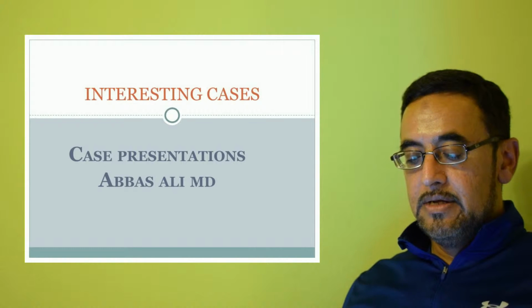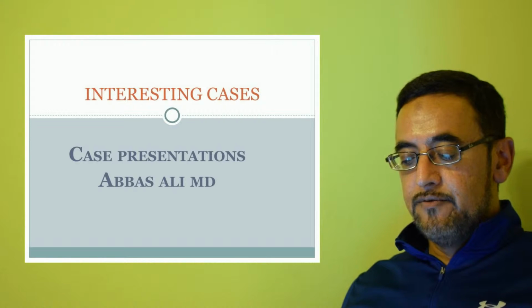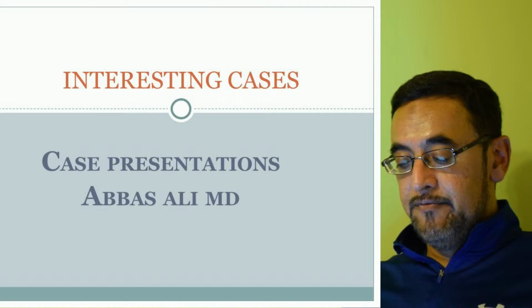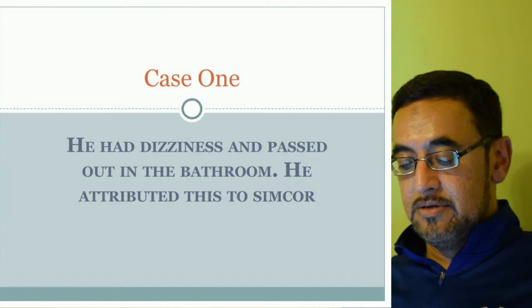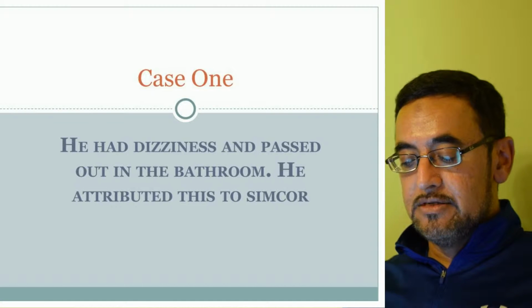www.drabbasali.com. Today I would like to go over a few interesting cases. The first patient is a gentleman who had dizziness. He fainted, passed out, and he attributed his symptoms to a medication he was on, Simcor, and these symptoms did not recur. Simcor does not cause syncope.